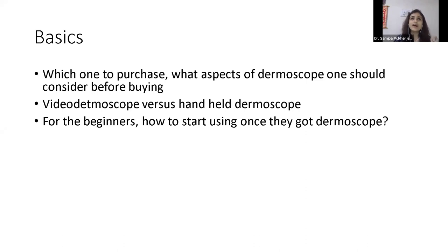The place where I find using dermoscope as a beginner very tricky, or which I used to find very tricky, was for vascular lesions. It is difficult to suspend the dermoscope on the ultrasound gel when you are initiating your practice in dermoscopy, because you don't have that acumen to handle your dermoscope. But with practice, I think you can go ahead and learn.